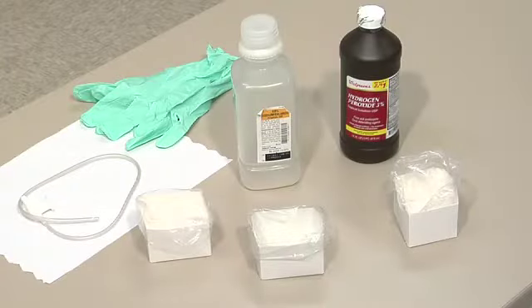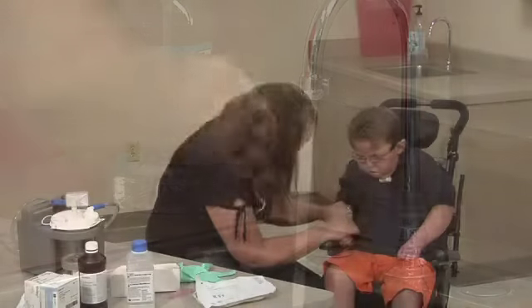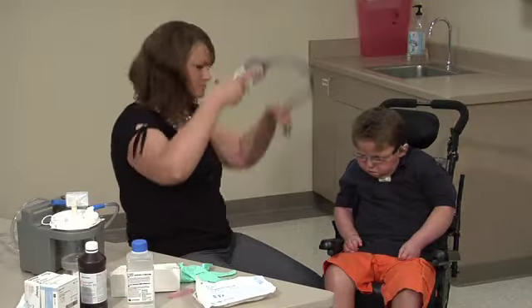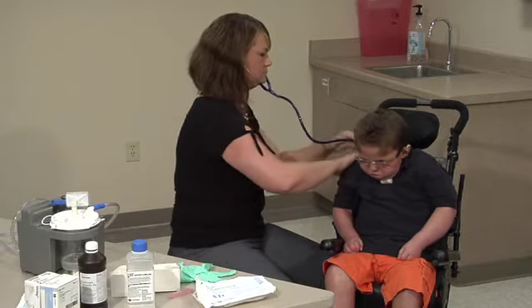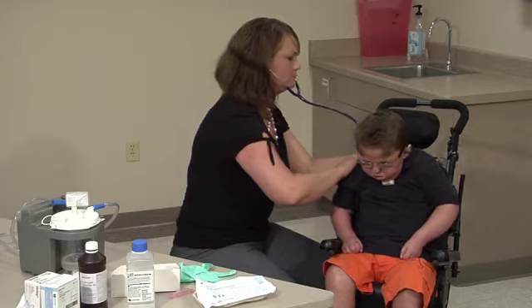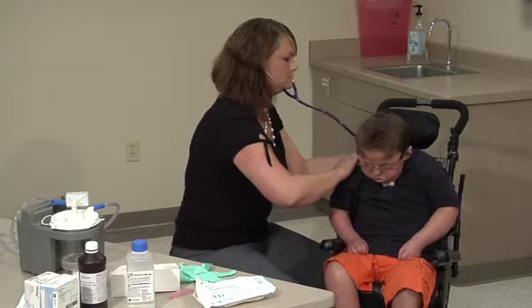Assemble the needed supplies. Review the health care provider's order and or the student's individual health plan. Wash your hands. Perform a respiratory assessment. The respiratory assessment should be an ongoing process to determine how well the student is tolerating the procedure and the amount of time and suction attempts that are clinically indicated.